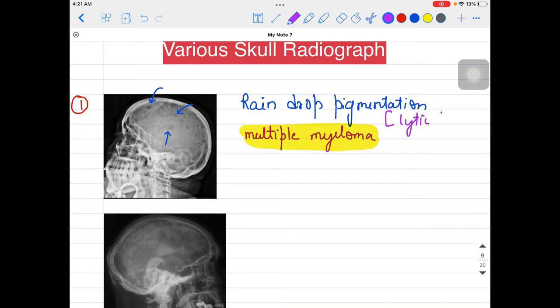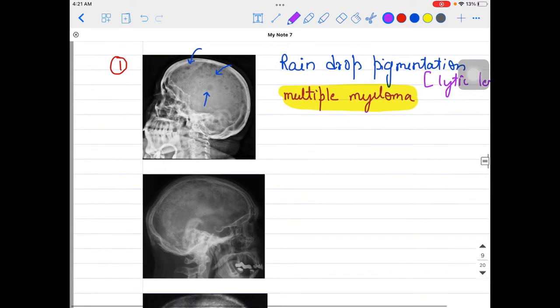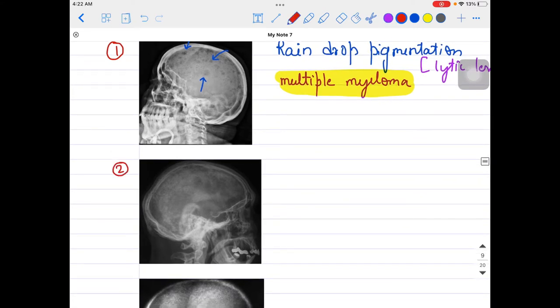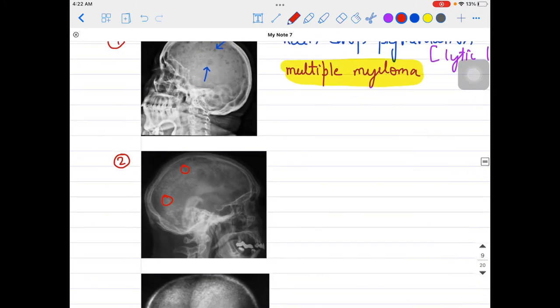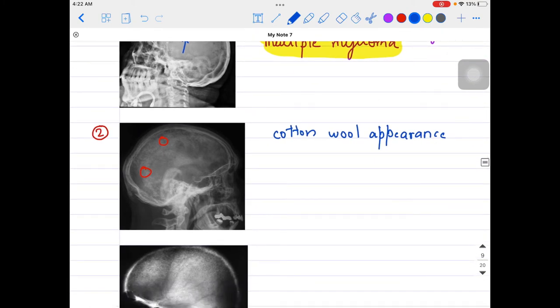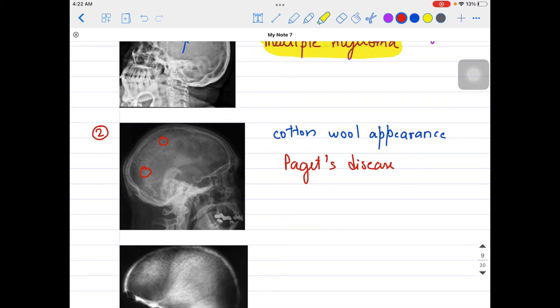Raindrop pigmentation or raindrop lytic lesions may also be the phrasing used in the MCQ. Moving on to the second appearance — this one on screen can be compared to cotton wool. It is very popularly called the cotton wool appearance. This cotton wool appearance is very commonly seen in Paget's disease. You must have heard about Paget's disease in medicine and orthopedics — this is its special skull appearance, and it is very frequently asked in exams.